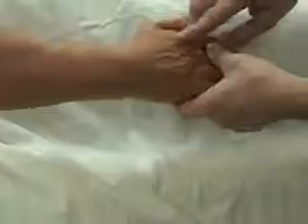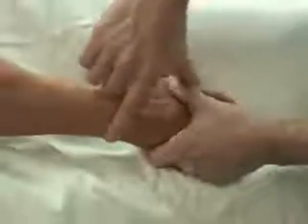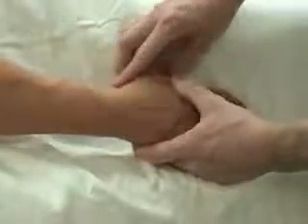The most important part of starting an IV is choosing a good site. IVs are like real estate. Location is everything. Knowing how to find a good vein is crucial to a successful IV start.